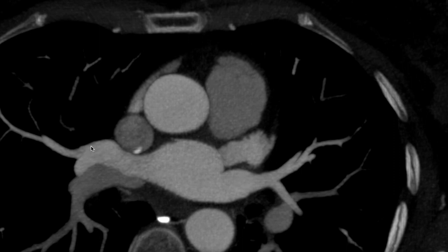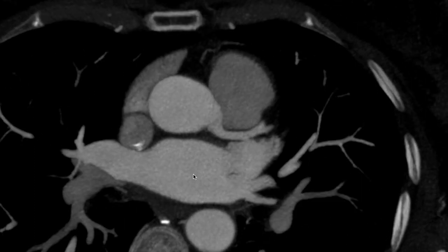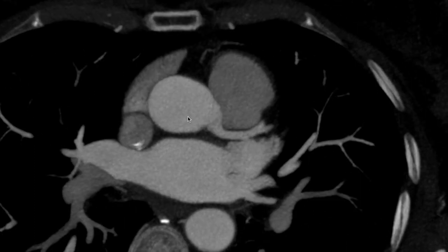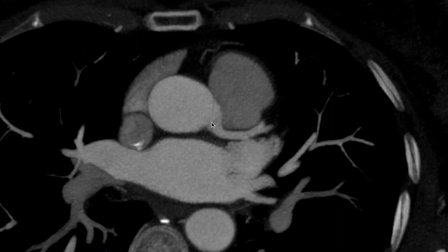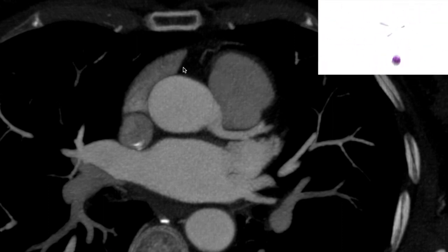We have the pulmonary veins opening into the left atrium. As I scroll down, we have the aortic root here — this is the left coronary sinus, it is giving off the left main coronary artery. This is the right ventricular outflow tract.